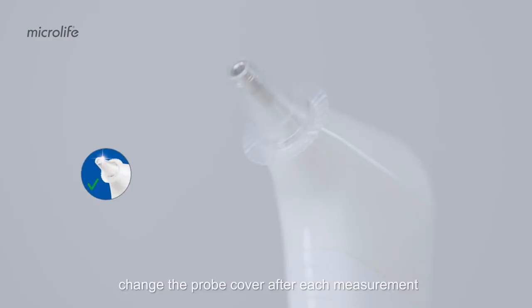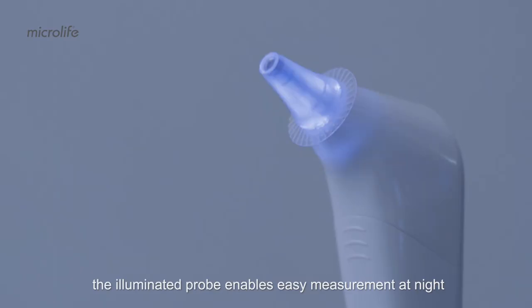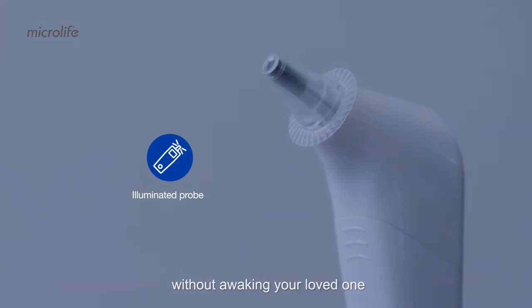Change the probe cover after each measurement. This is essential to get accurate readings and to eliminate cross-contamination. The illuminated probe enables easy measurement at night without waking your loved one.